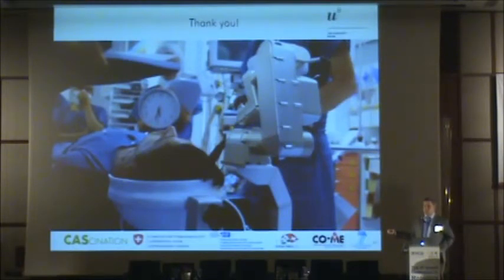Everything that relates to the robot, accuracy of the digitization and its tool calibration, you can actually look around and look into industry. How do very precise CNC machines, for example, do alignment and calibration issues with tools, and how is that set up? That was not the hard part. The problem really for us is where our system links to other systems, and most prominently it's the imaging, where we really have to make sure the imaging is right.